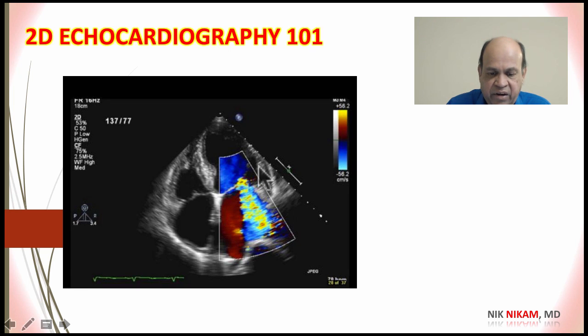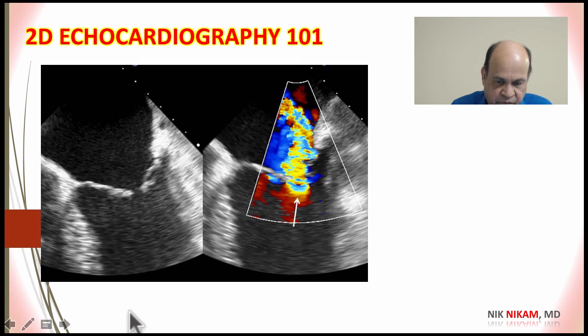The mitral regurgitation degree is calculated by many factors, such as the opening here at the valve of the jet and the amount of mosaic pattern that we see and the extent to which the pattern fills the left atrium. And we also look at a waveform, and here's another example.